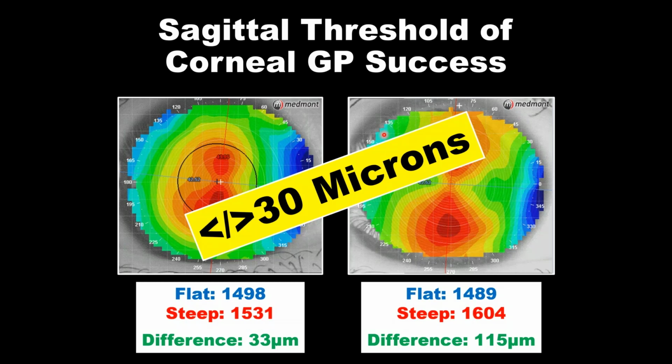And we're seeing with many of the manufacturers, that appears to be their threshold when they begin to use toric landing. Now, something I should make sure I communicate is where is that 30 microns measured, and that's at an 8mm chord.